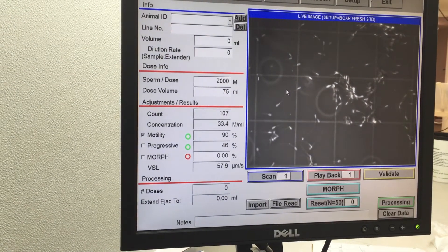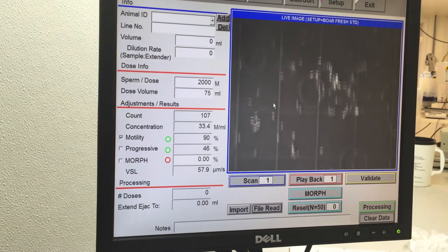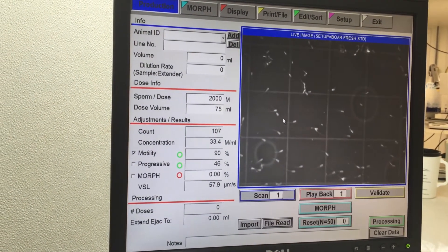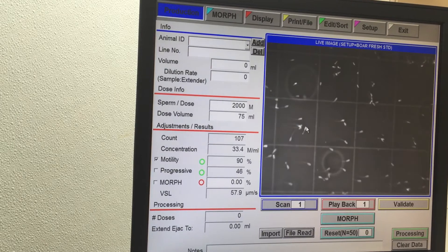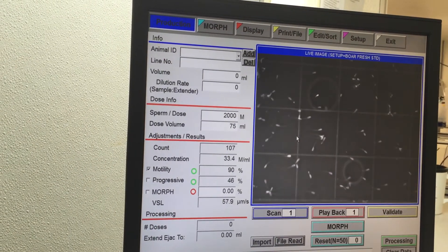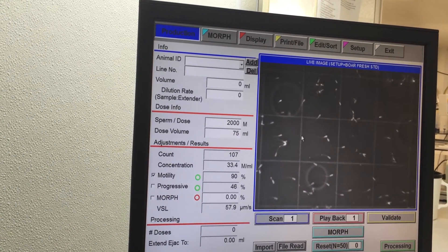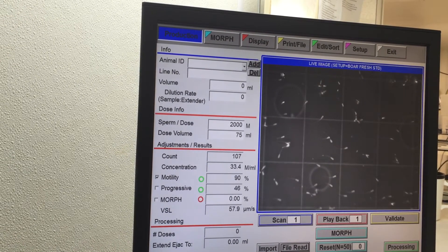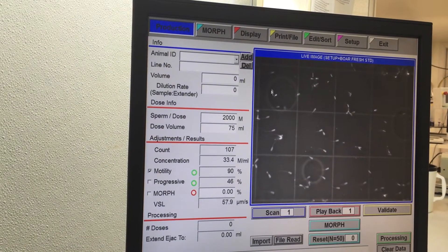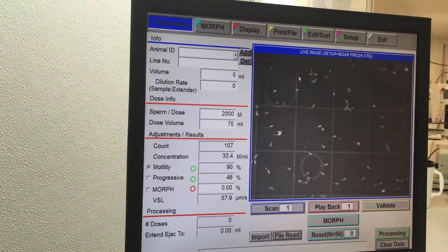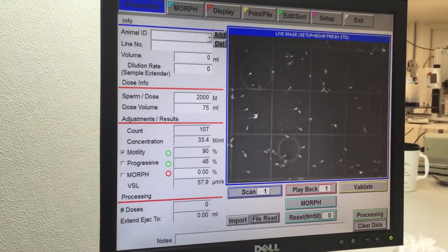Generally it's good if you've got clumps to try to find an area that's not as clumpy, so I think we're going to pick a row right out of the center here. We're going to begin to count now. We want to count heads that are within the range and heads that are on two lines. We usually count top and left; we don't count bottom and right. In the case where we're counting across a row, we end up getting one of the center lines anyway. If we're doing it diagonally, we would just count top and left, top and left, top and left.